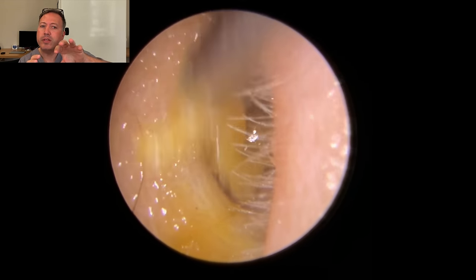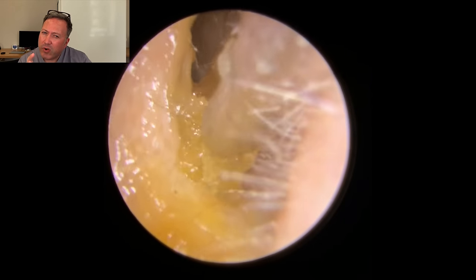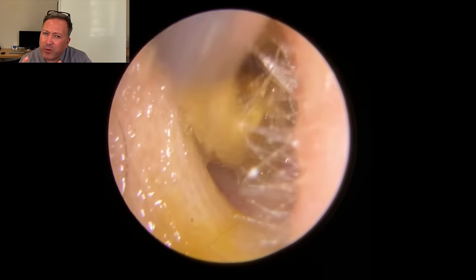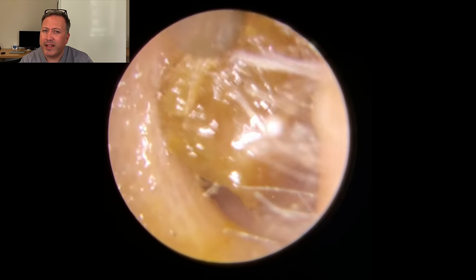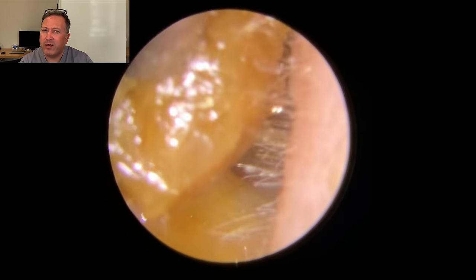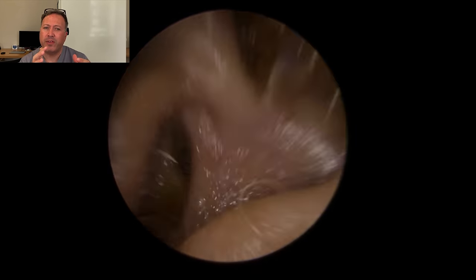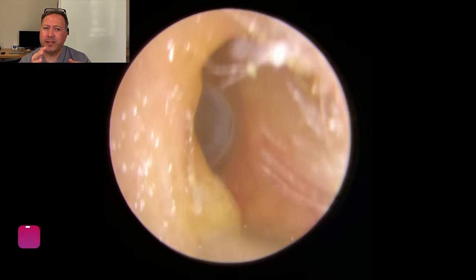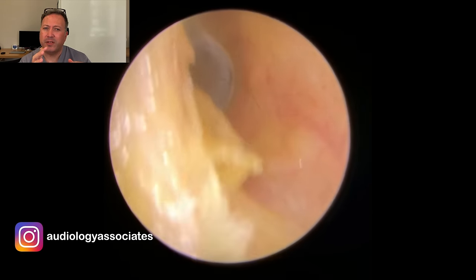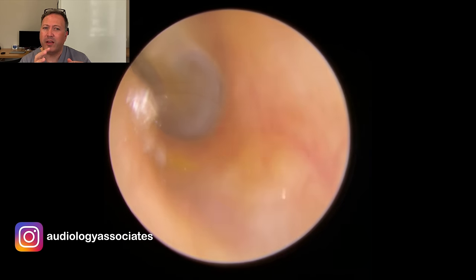And then you can see we're just getting a good grip on the skin debris, trying to get enough of a grip to pull this away. It's really holding in there tightly. There we go. If we wiggle this up and down, you can see that's the actual wax portion of this blockage that's come away there. And now we're just going to take this section. You can see the loose skin there. So we're just going to get a good grip, wiggle it up and down. There we are. And off it comes.